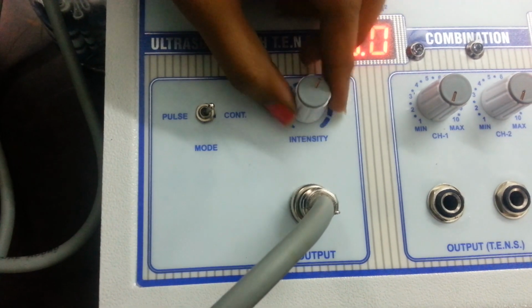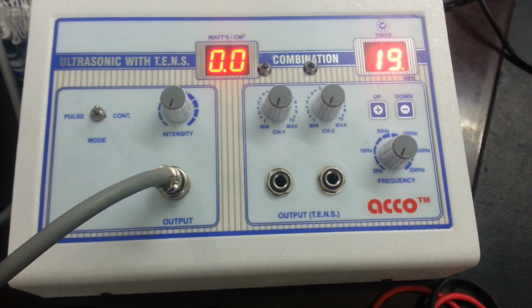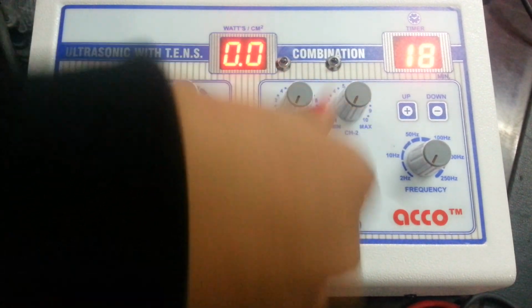After treatment is completed, make the intensity knob at 0. And now we will show you the demo of the TENS unit. Attach leads and wire.